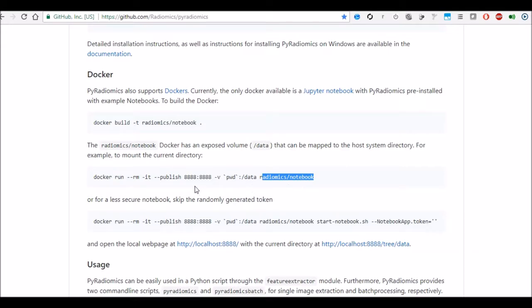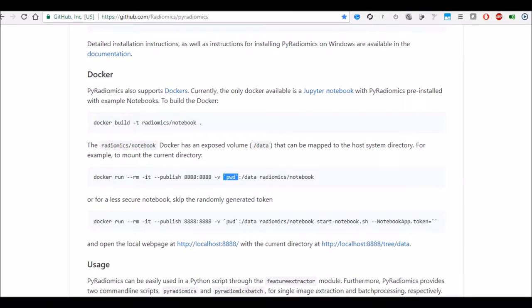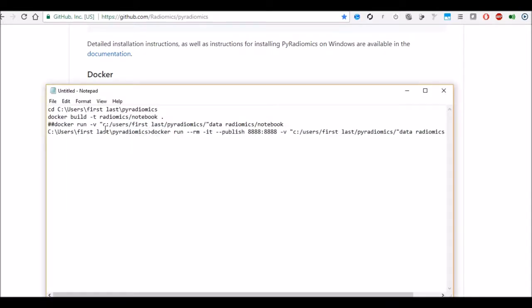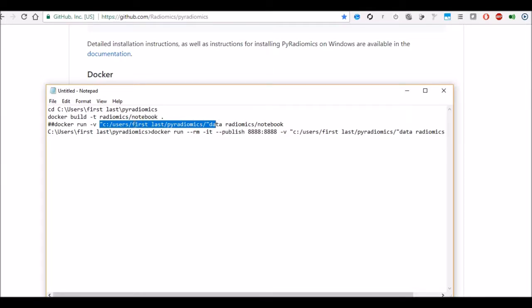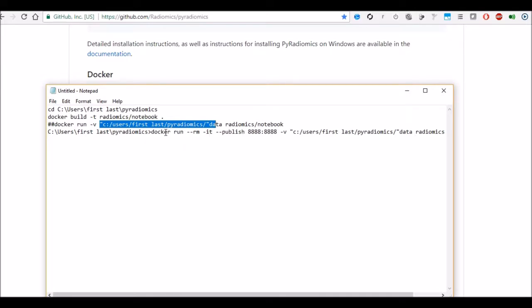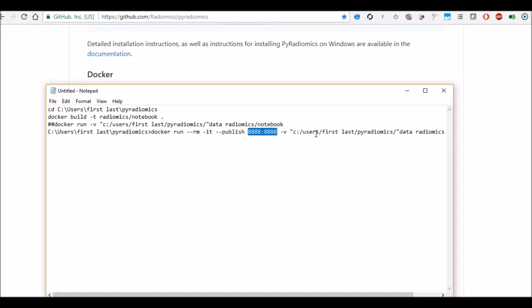One of the things I struggled with is windows 10 does not recognize pwd command so I had to find solution for that. You had to specify the absolute path so absolute path is specified using double quotations. So I have users first last name pyradiomics and data, so it could be any username you might have. In my case it is first space last, because I have a space I had to use double quotations to make sure this volume can be interpreted by docker. So by providing this absolute path I can publish my application which is jupyter notebook, it will be ported on 8888.